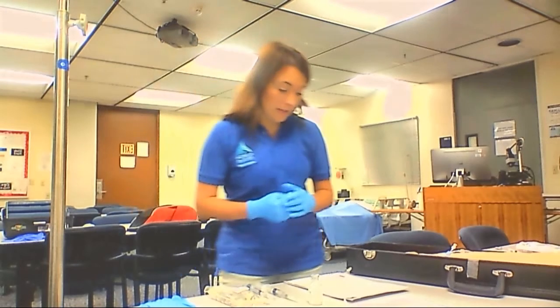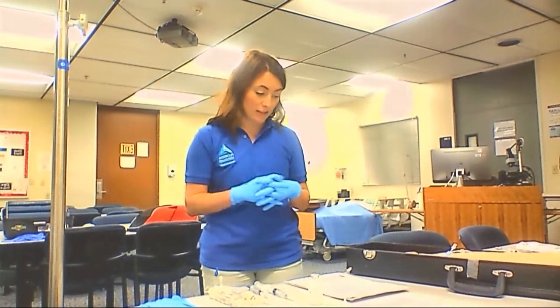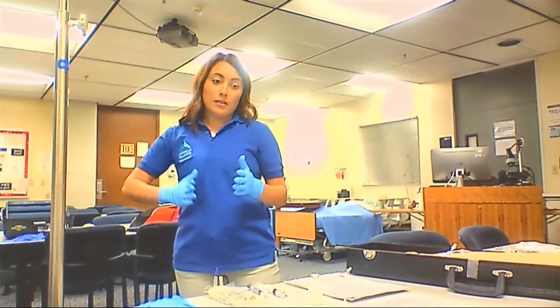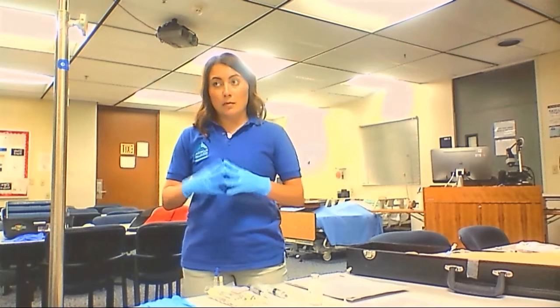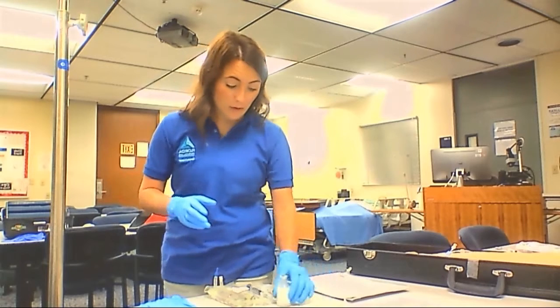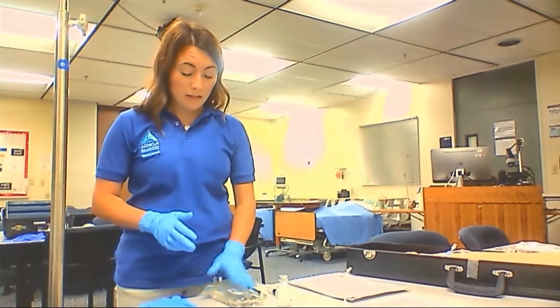It is also my responsibility to make sure that the patient has no allergies to vancomycin, which this patient does not. I have already calculated the correct dosage rate, so it's going to be done over 17 drops per minute, which I will set later on after my IV is set and hung. At this time, I'm going to inject my vancomycin into my saline solution bag.